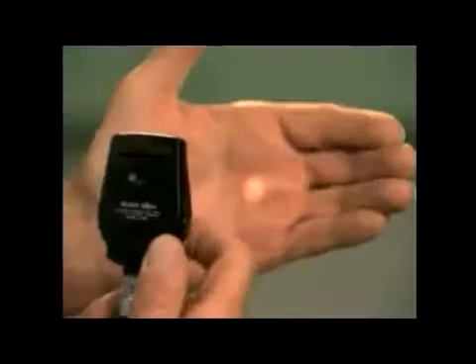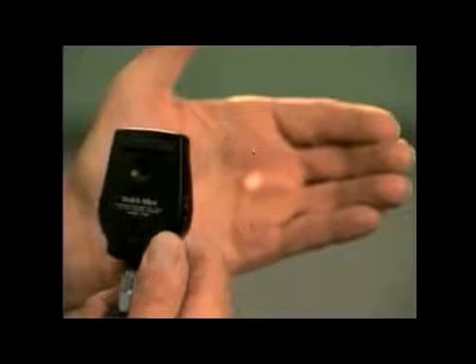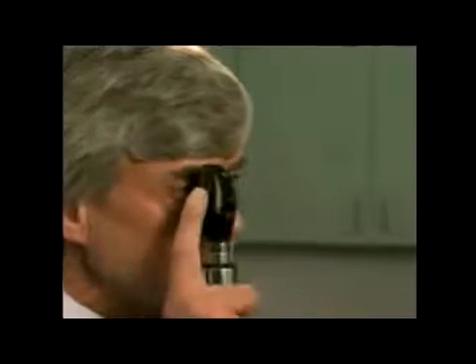Most practitioners will start with the high-intensity halogen lamp at full illumination, then lower it for patient comfort. Select zero on the illuminated lens disc and start with the small aperture. With your right hand, hold the ophthalmoscope vertically in front of your right eye with your index finger on the lens dial so you can change lenses easily.